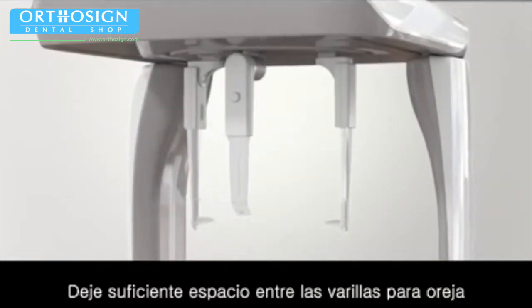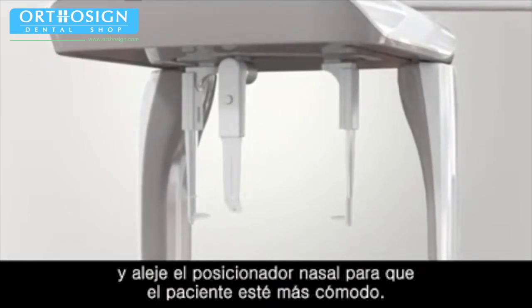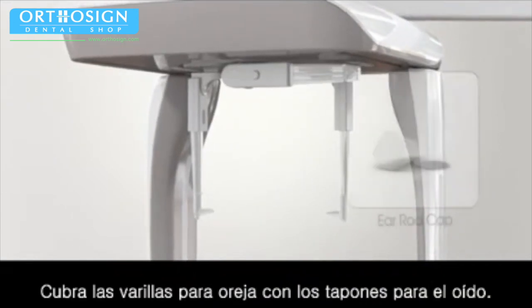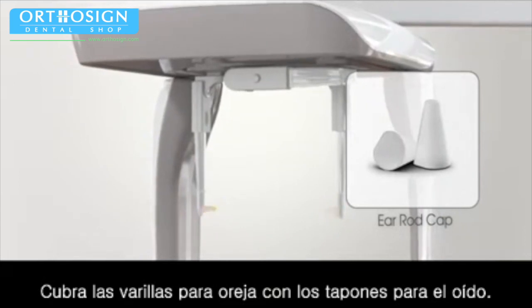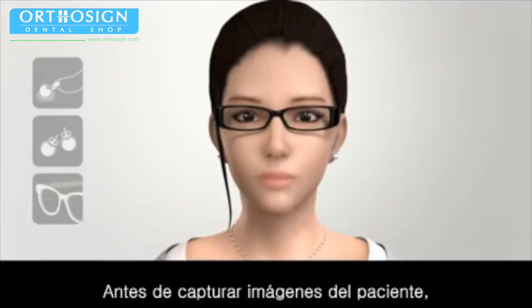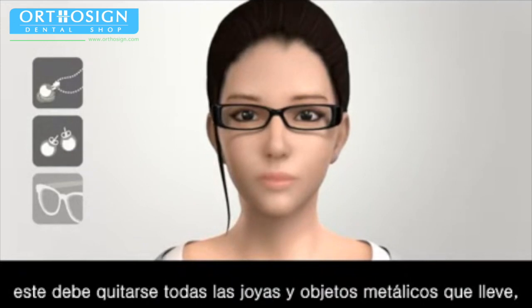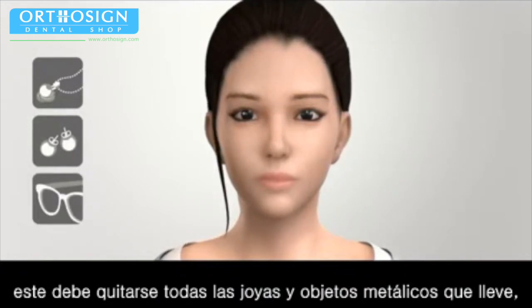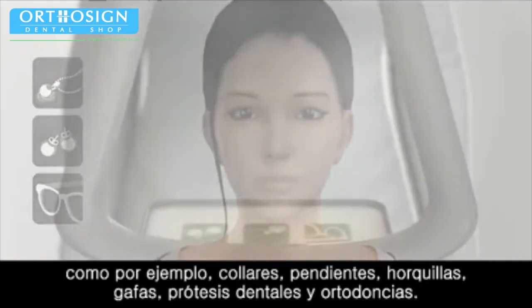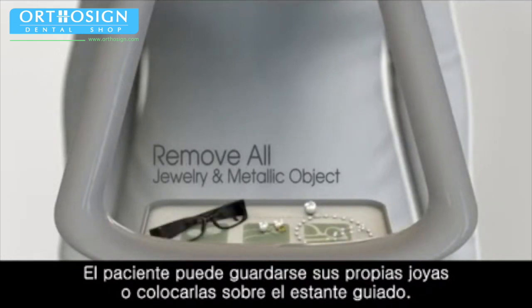Leave enough space between the ear rods and move the nasal positioner out for the patient's convenience. Fold the nasal positioner up. Cover a cap over the ear rod for patient safety and guide the patient to the unit. All jewelry and metallic objects such as necklaces, earrings, hairpins, eyeglasses, dentures and orthodontic appliances should be removed before patient image capturing.